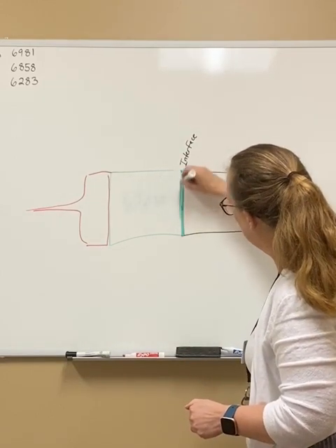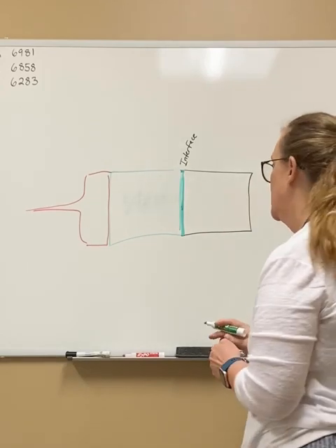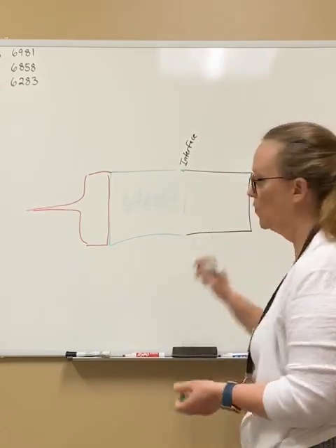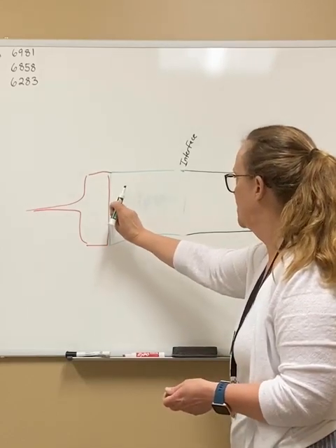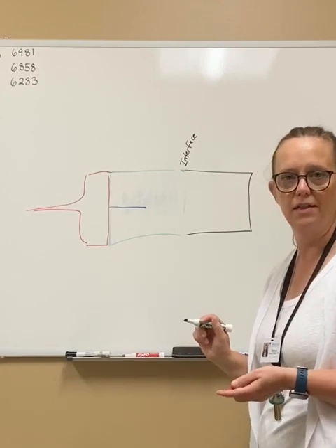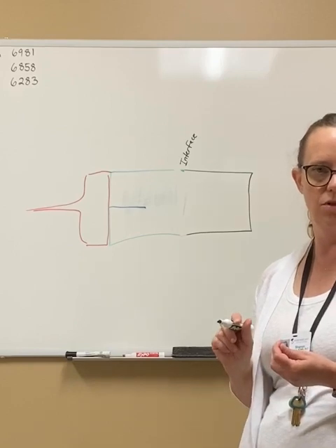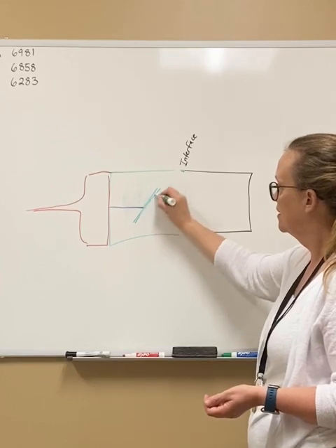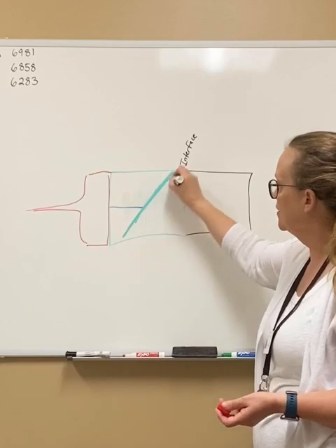have a wave coming at this tissue at an oblique angle. Let's just make it a little more realistic here. The wave is going to be traveling this direction from the transducer, at least at first, but your interface might not be exactly perpendicular to the wave front, to the wave direction. It could be sitting like this. So this could be your tissue interface sitting at an angle.